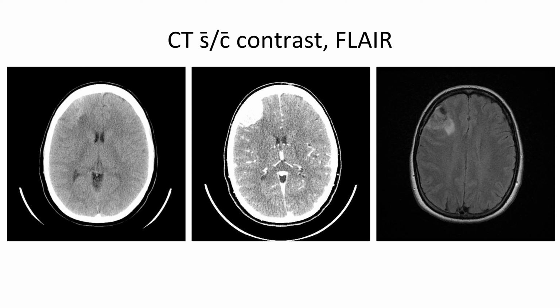If you remember back to when we talked about histopathology of glioblastoma, that's what this man had. So you can see at the right frontal lobe some sort of mass that is enhancing with the contrast. And then we can also see on the MRI image on the right, the FLAIR. You can tell this is MRI again because it's high resolution, the bone is dark, and you can see that the cortex is light while the white matter is a little darker. So this clues you into this is not a normal T1.